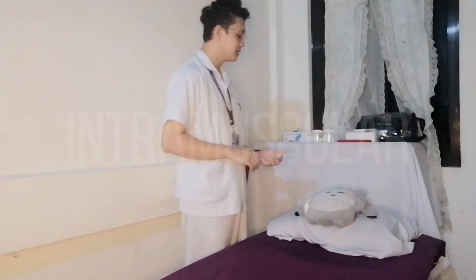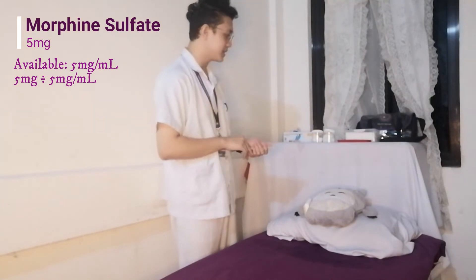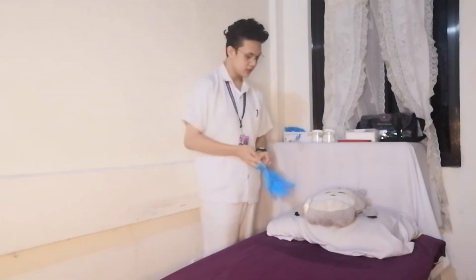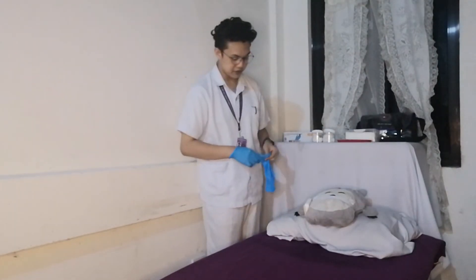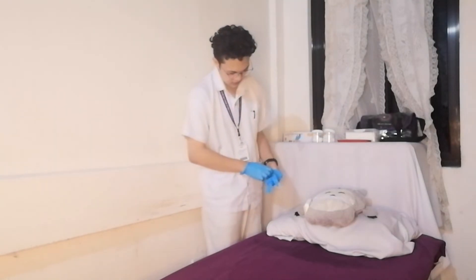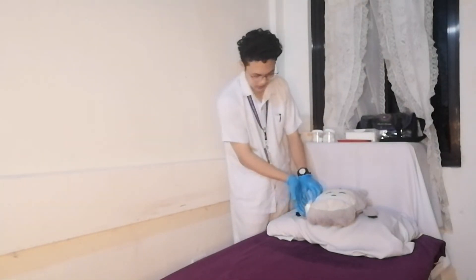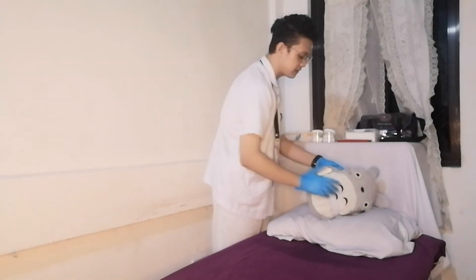Your physician also ordered you five milligrams of morphine sulfate for relief of moderate to severe pain. The available stock for this medication is five milligrams per milliliter, so I'll be administering one milliliter of morphine sulfate. Side effects may include vomiting, nausea, or sweating. Upon inspecting for the injection site, your ventral gluteal — your right hip — is ideal since it has more muscle mass. I'll be inspecting your skin around that area. No lesions found, no bruising as well. No tenderness is found — tenderness might not be suitable for intramuscular injection. I'll be assisting you to a sidelying position for a better surface area of the injection site.